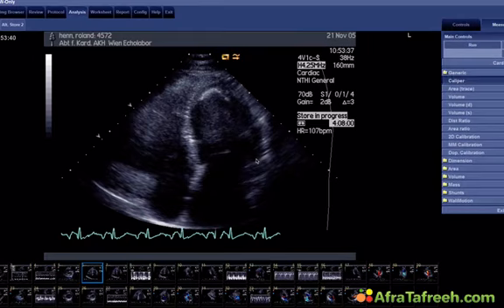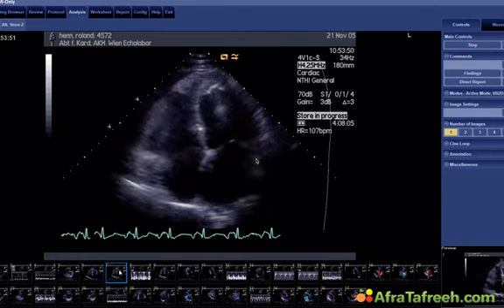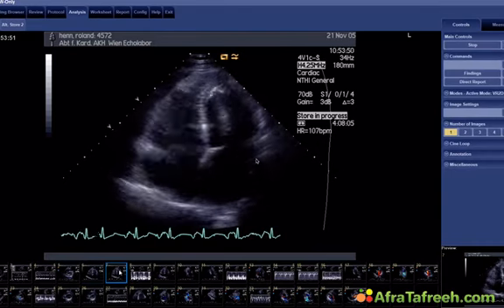Very difficult to see the lateral wall, but I would assume it's somewhere here. Okay, we have 52. Remember, 50, 55, that's kind of where the range starts of a dilated left ventricle. So it's not very large, but it seems to be dilated. It was a normal-sized man, by the way.